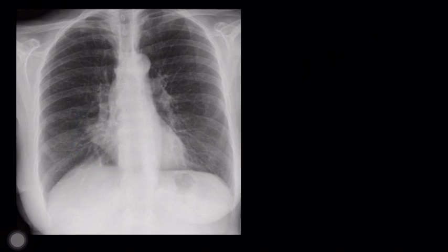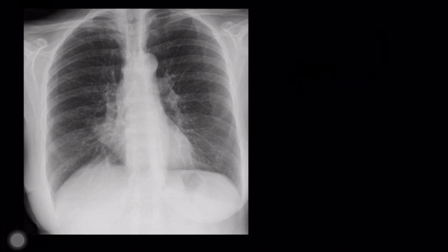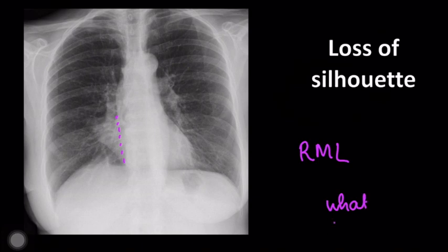You can see an abnormality here — an opacity. Next, you have to find out where this opacity is. For that, apply the silhouette sign. Look carefully: the right heart border cannot be delineated, which means the opacity is situated in the right middle lobe. So we have answered two questions — what is the abnormality (an opacity) and where it is (the right middle lobe).